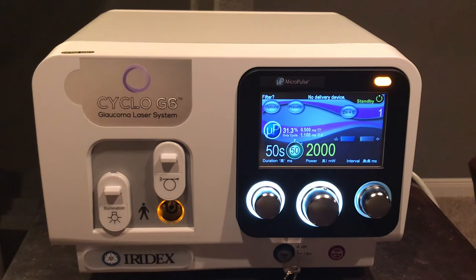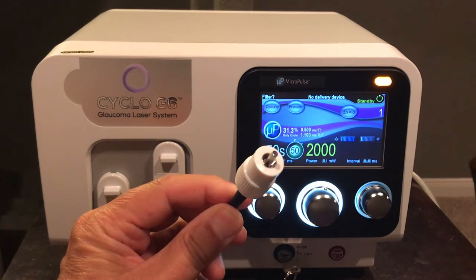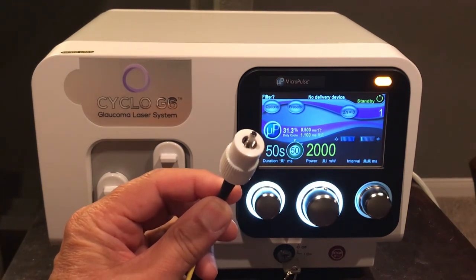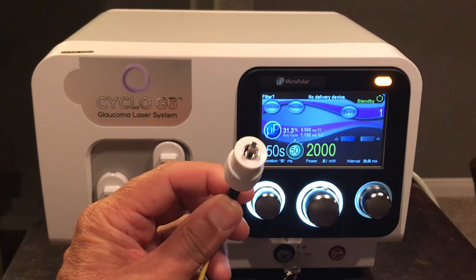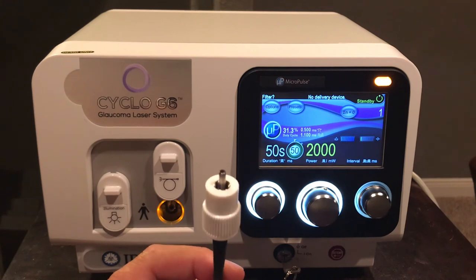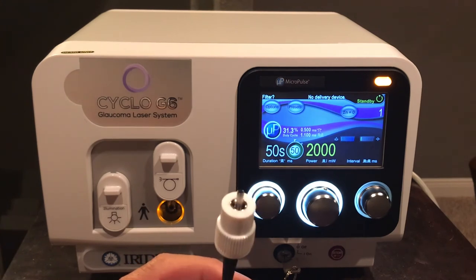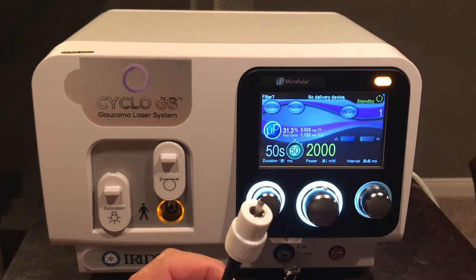You cannot perform a micropulse procedure with a continuous wave probe, nor a continuous wave procedure with a micropulse probe. In the hub of each delivery device there is a small RFID chip that designates which procedure is to be performed by which delivery device. This is a safety feature to prevent accidentally using the wrong mode. Micropulse can only be done with micropulse-approved probes, and continuous wave only with continuous wave delivery device probes.